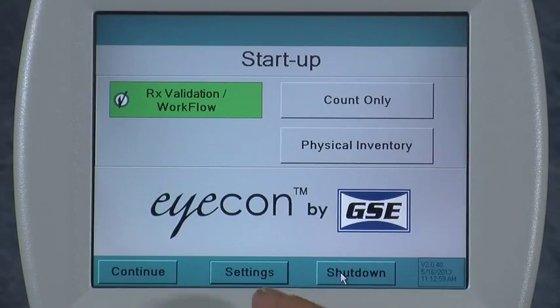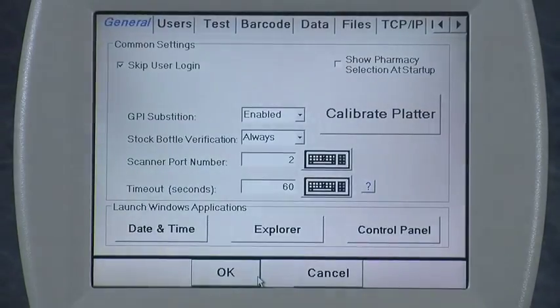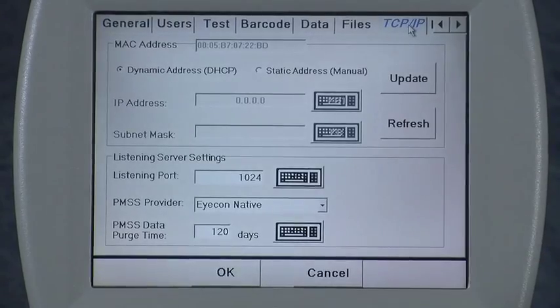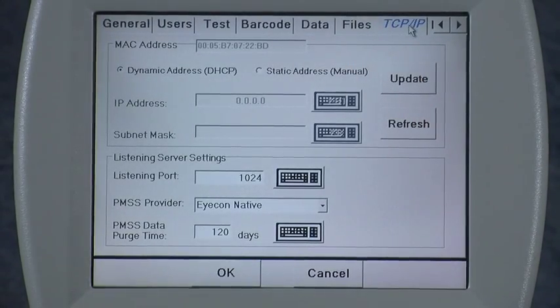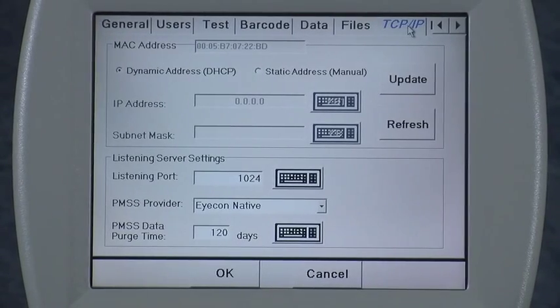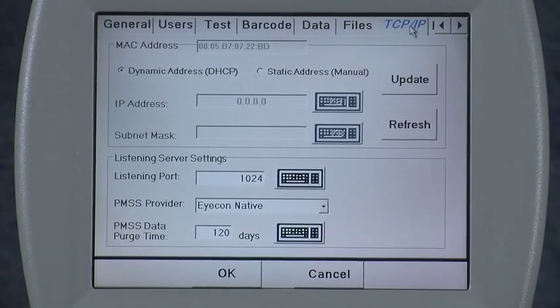From the startup menu, press the Settings button then select the TCP/IP tab. At the very top you'll see the MAC address. Your pharmacy management software provider may ask you for that if you're doing the interface.